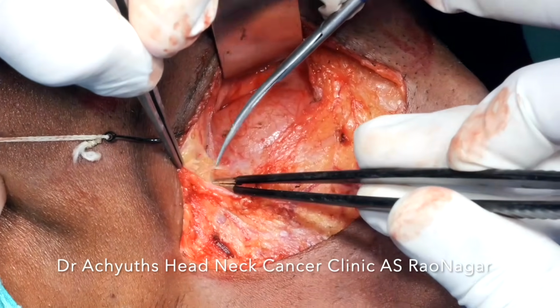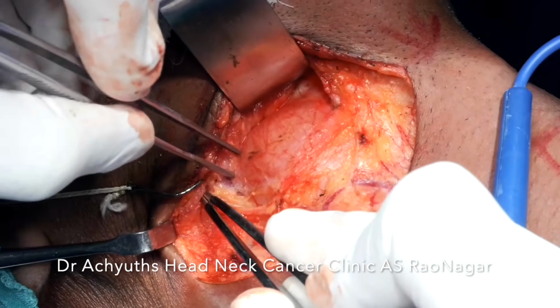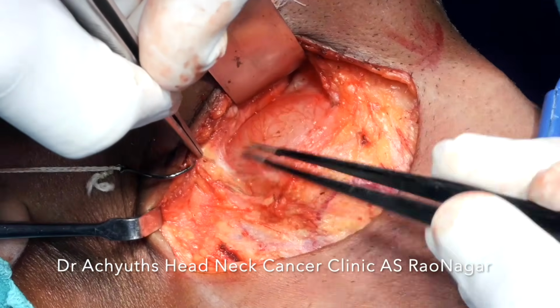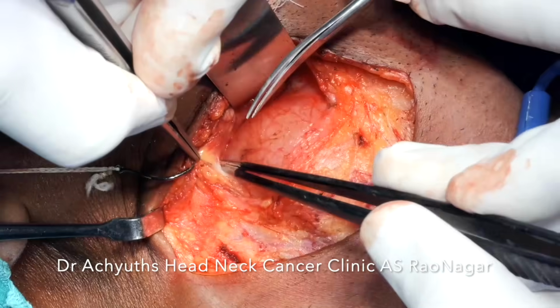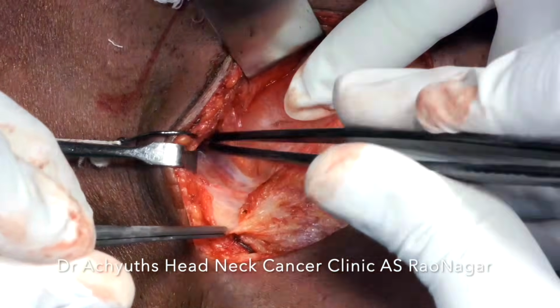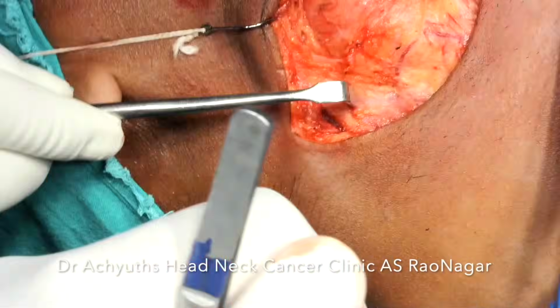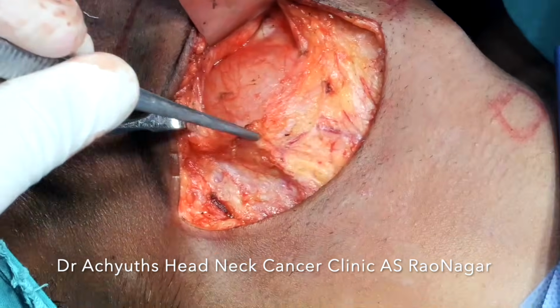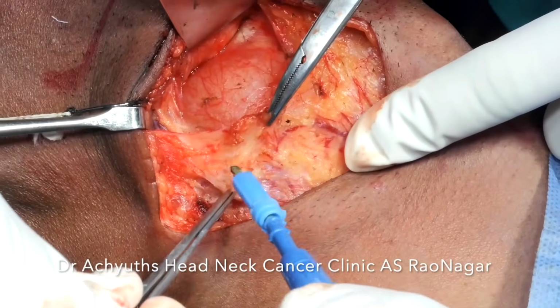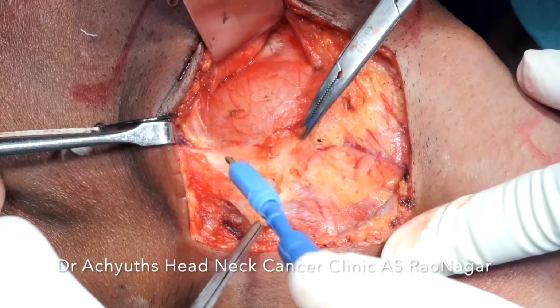Now once the superior part is relatively free, we will come on to the lateral part. So this is the common facial which we are speaking about, which is not coming into the way of dissection, so we don't have to divide that common facial. Now once that part is done, we will try to divide it from the sternocleidomastoid muscle. So like we divide for any neck dissection, we will divide the fascia from the medial border of the sternocleidomastoid muscle.